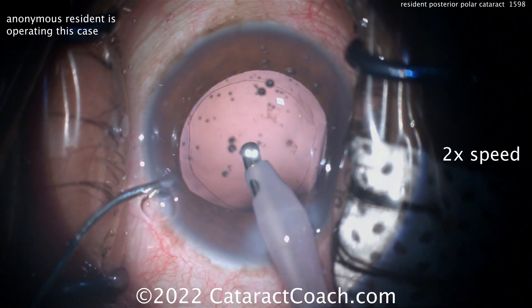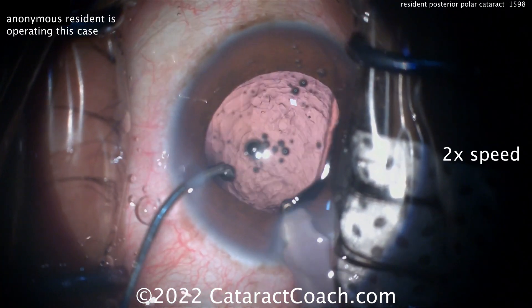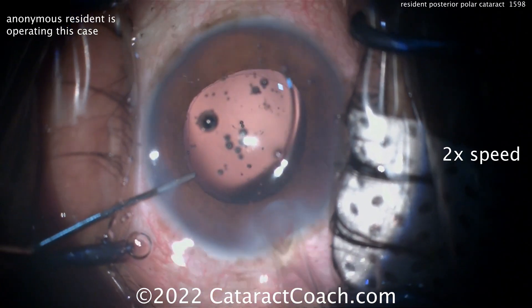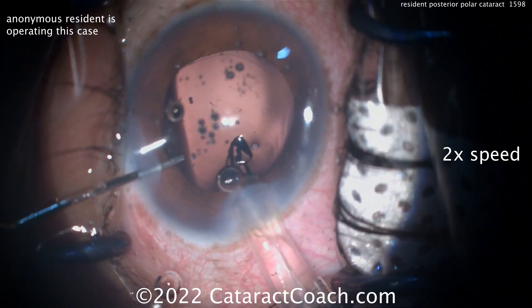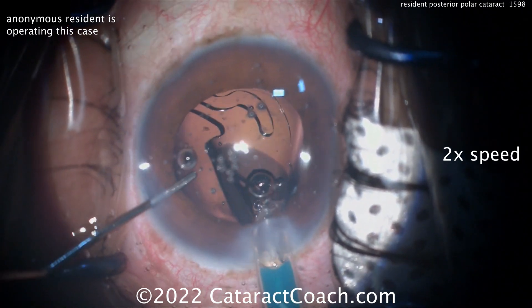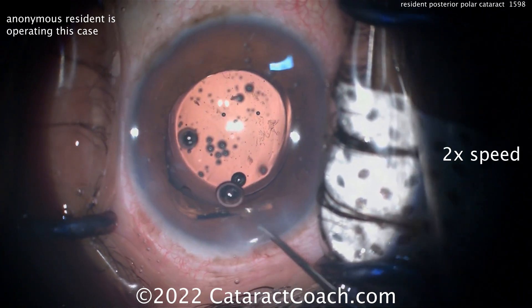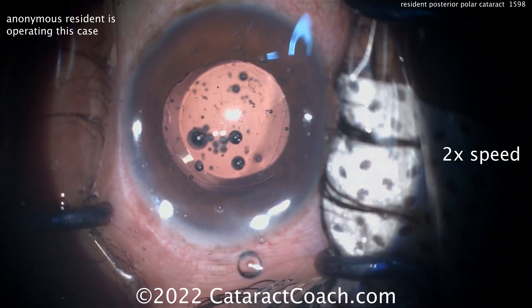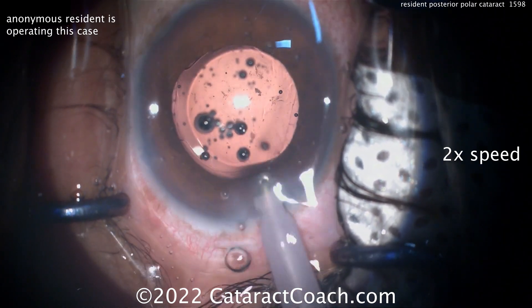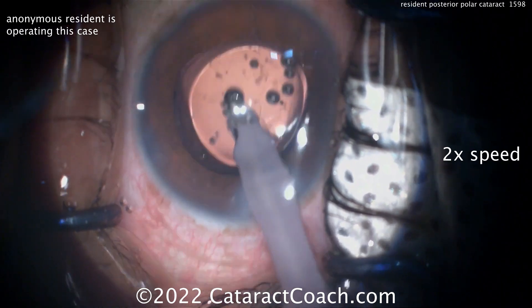Also, inject your viscoelastic to fill the bag before coming out of the phaco probe. Do not come out of the eye and let the posterior capsule come forward and the anterior chamber collapse. Here comes the lens — it's a single-piece going in the capsule bag. You can also put a three-piece lens in the bag, and therefore if you do have a break in the capsule as you are inserting the lens, then you've got other options for placement. When the lens is already in the eye, if it's a three-piece, you can opt to capture it — haptics in the sulcus, et cetera.